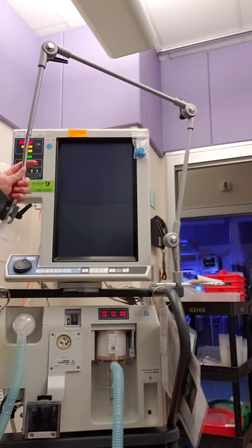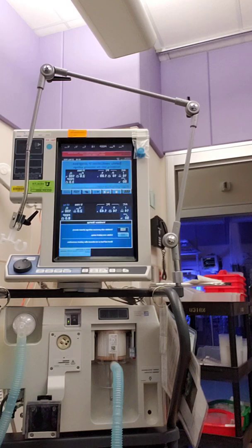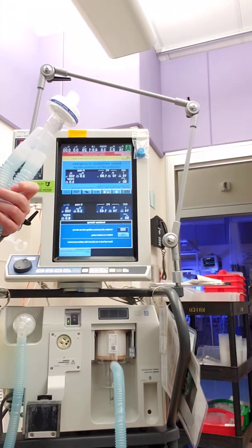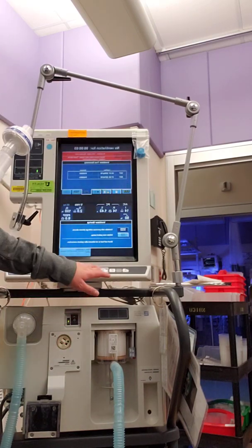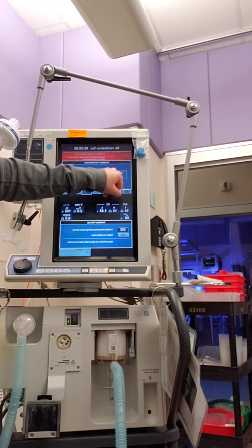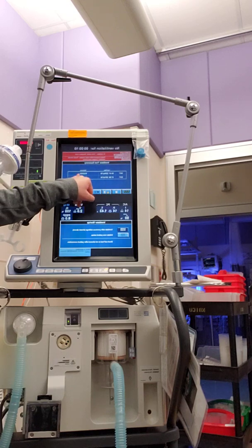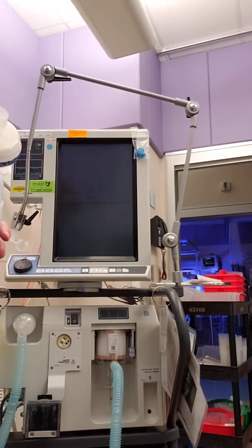It will restart. Oh. You like how I told you not to block the Y and then I blocked the Y? So over here, you can see the SST, the last time we ran it was the time, the date of now, and that we passed. Okay, we're going to turn that off. Sorry, Ben.